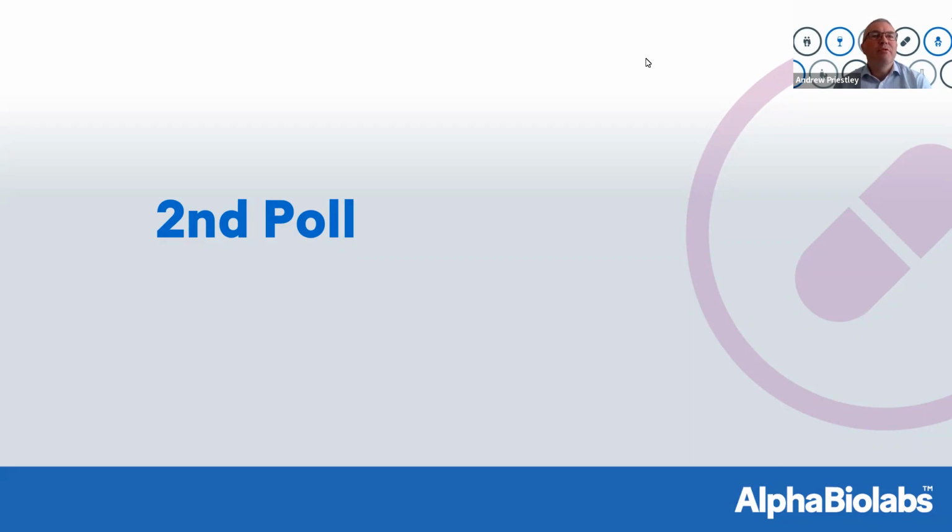So first question, what is the maximum window of detection for drug usage that can be found with head hair testing? It's quite clear there. So 93% of you got that right. It is up to 12 months realistically. And question 2, if your client provided a 6 centimeter head hair sample for an overview only, how many results would you get? And 64% of you got the correct answer there. So it's 2 results, each covering a 3-month time period.